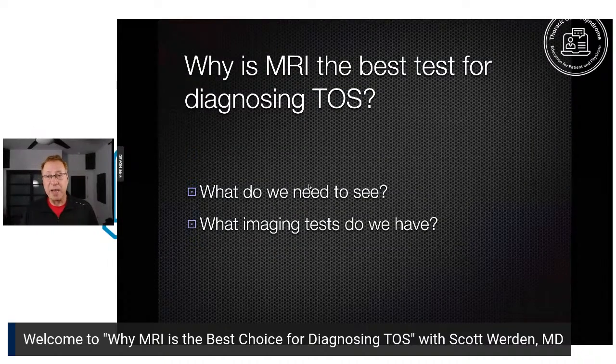Let me also remind you, as I tell a lot of my doctors, that the MRI, or any diagnostic test, isn't by itself meant to replace the clinical examination. It's meant to work with the clinical examination. So your doc suspects you might have TOS, get you the right kind of imaging. And besides diagnosing TOS, the right kind of imaging can show which type you have.